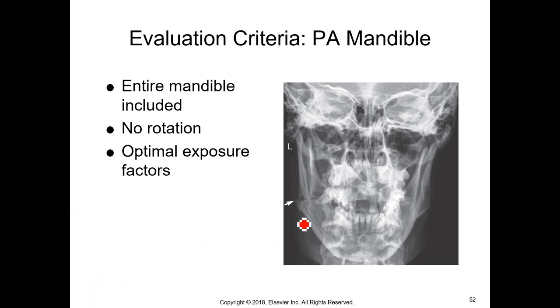If I had an angle on it, the jaw would be squared off, more like this, and then the condyles would protrude outward like this. So this is why that would be preferred, because the condyles are well visualized and it squares off the jaw. That's with the angle, that 20 to 25 degrees cephalic angle. The regular radiograph, that's pictured here, that's just a regular PA.